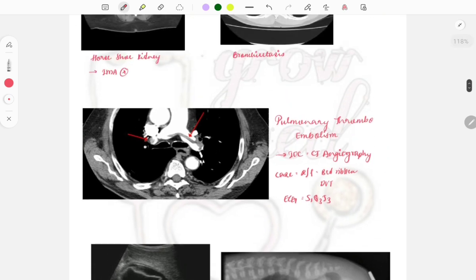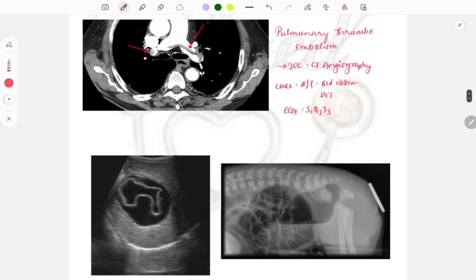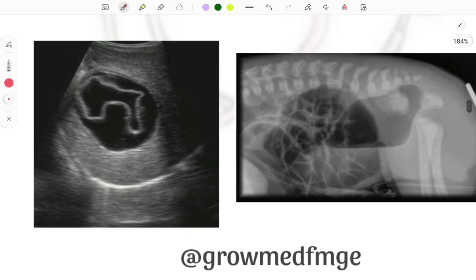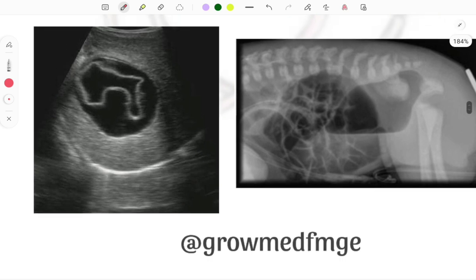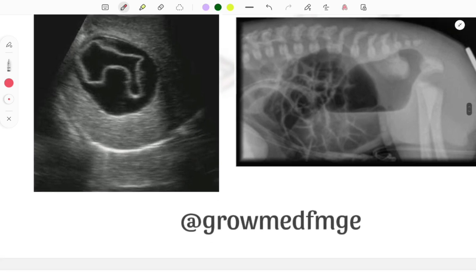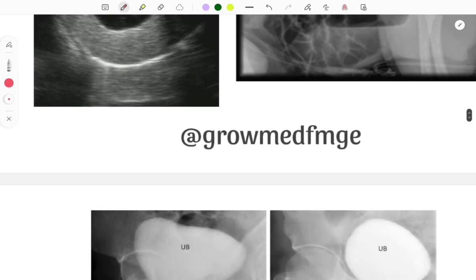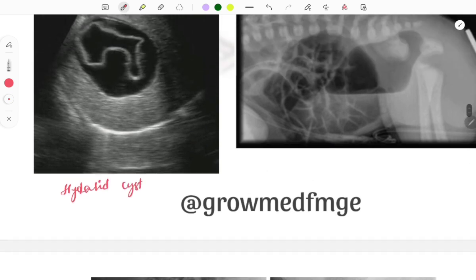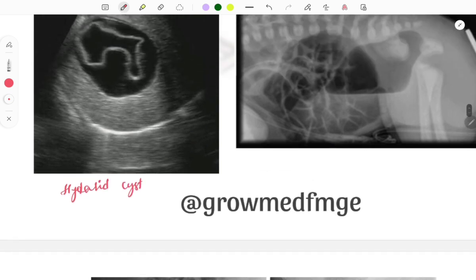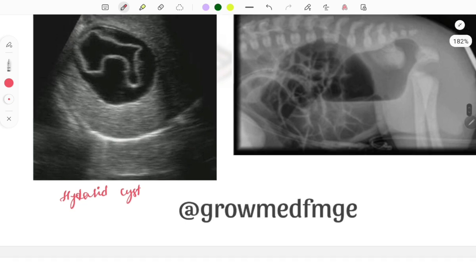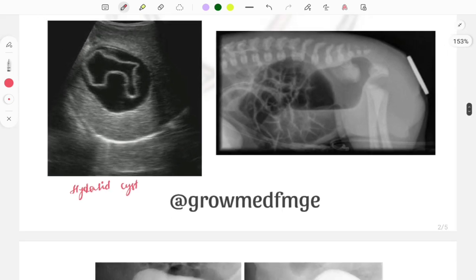The next image is of hydatid cyst — this sign is called the water lily sign, representing floating membranes floating in the liver. Hydatid cyst is an important topic and this image is frequently asked.